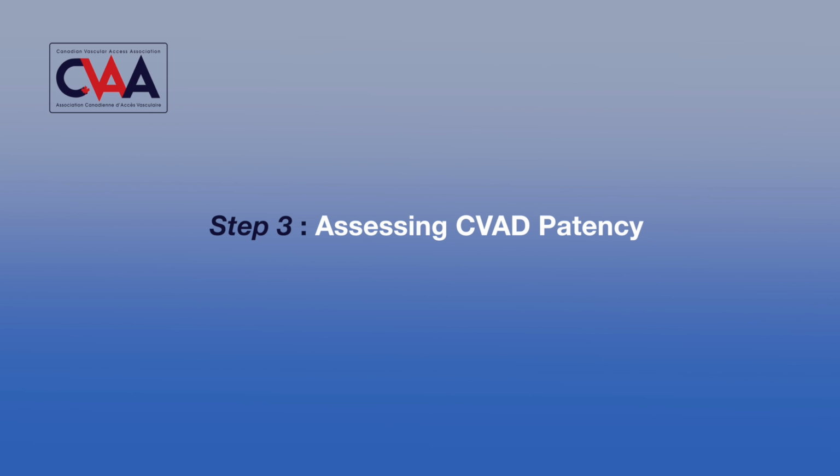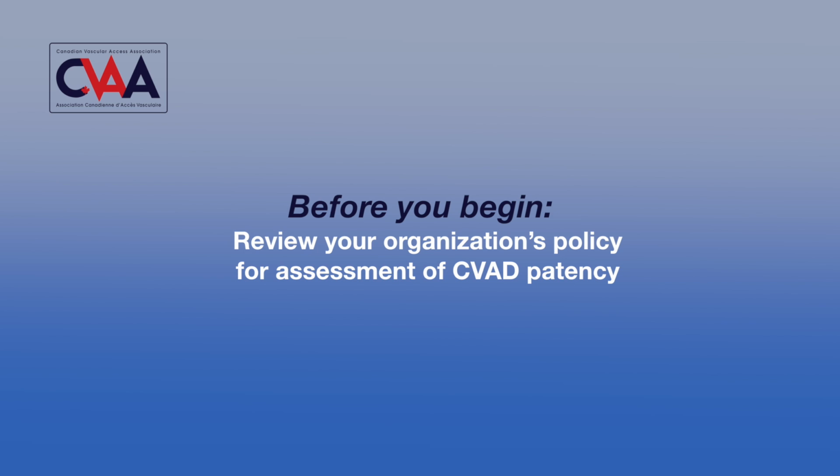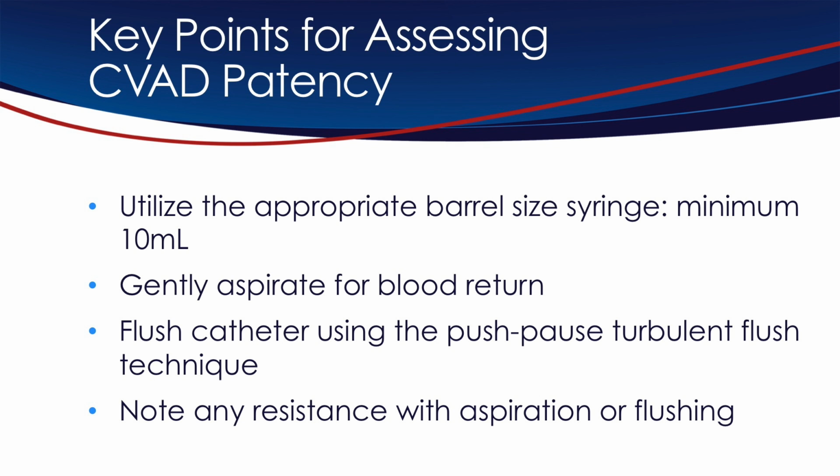Step 3. Assessing CVAD patency. Before you begin, review your organization's policy for assessment of CVAD patency and be familiar with it. Remember these key points when assessing a CVAD for patency.